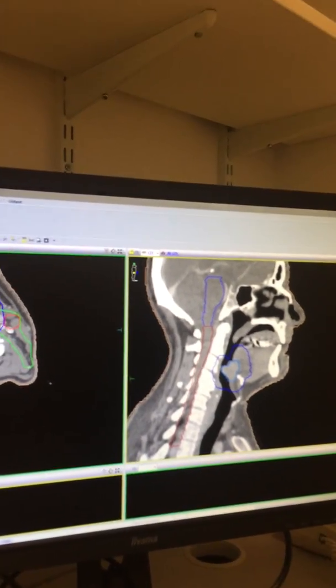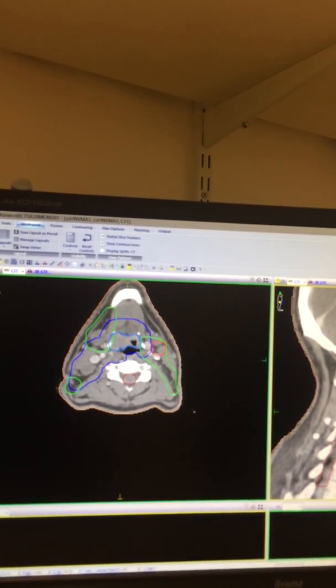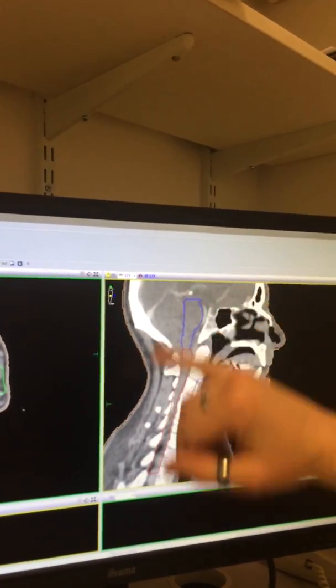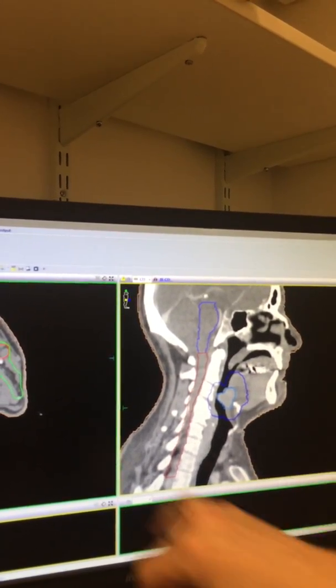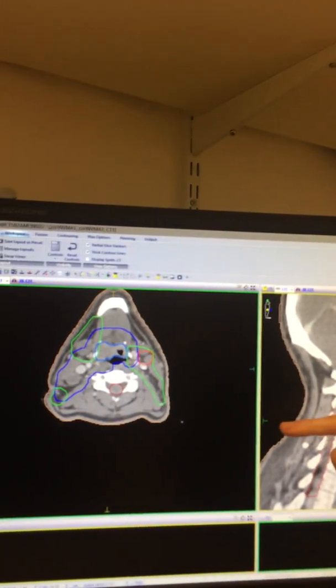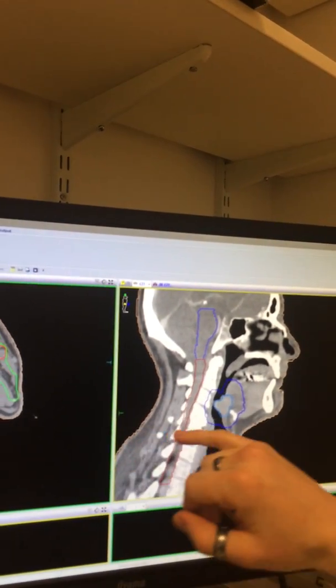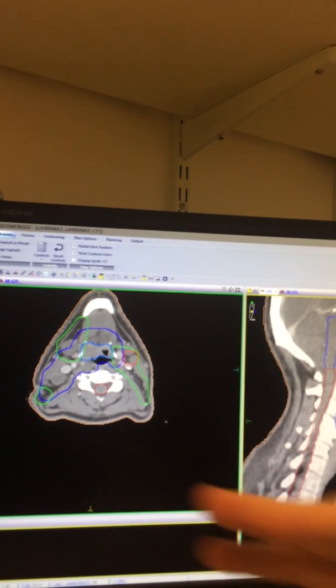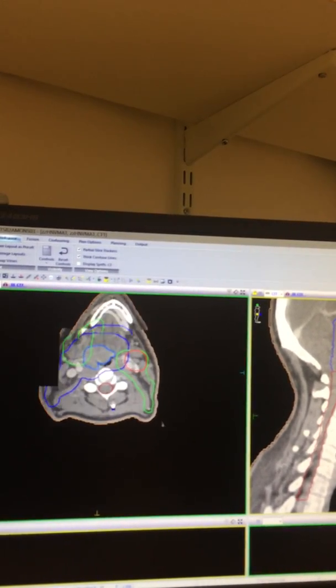So I'm a bit confused. Is this still the skull? Is it a slice through the skull? So this is the overall treatment. As you can probably tell, this is a head, and this is just a slice through that. So we're approximately at this level here, and we've got a 3D image that we work on. So we don't just work on just one slice. We travel throughout the patient.